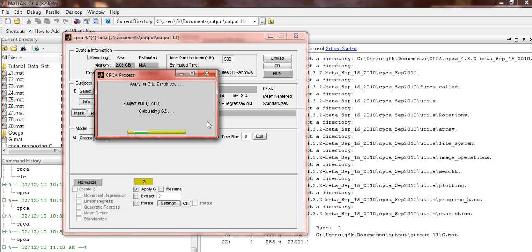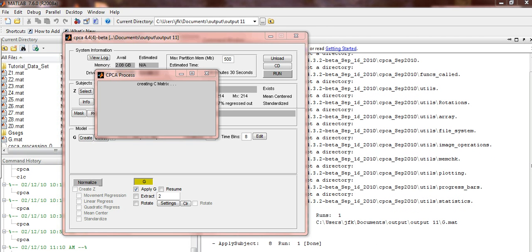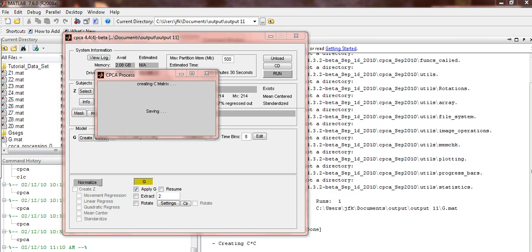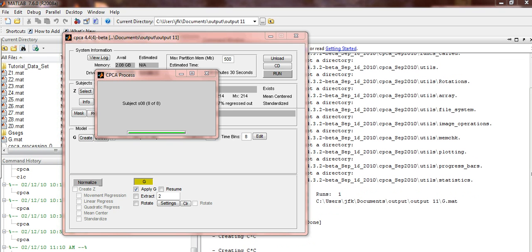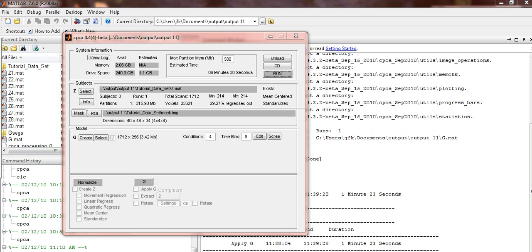It will now go through each of the 8 subjects, applying G to the Z matrices. It will also create a C matrix for each of your 8 subjects. Once this is done, you are ready to extract components.